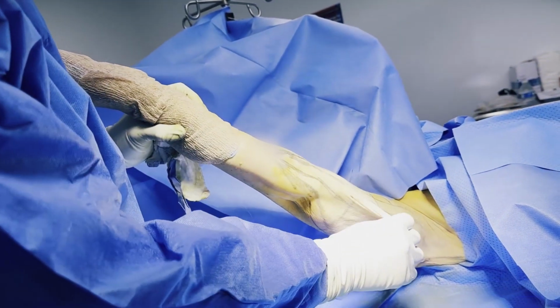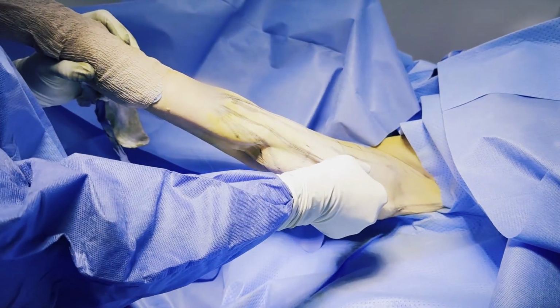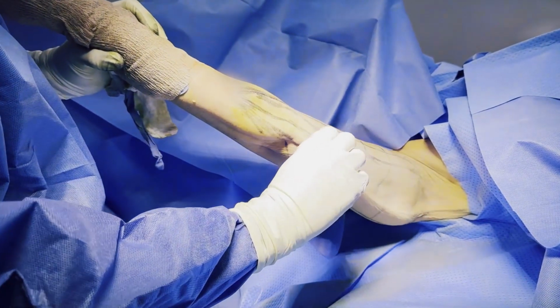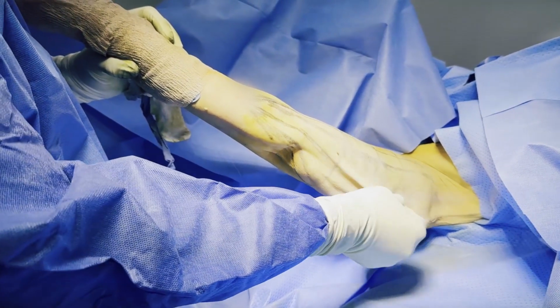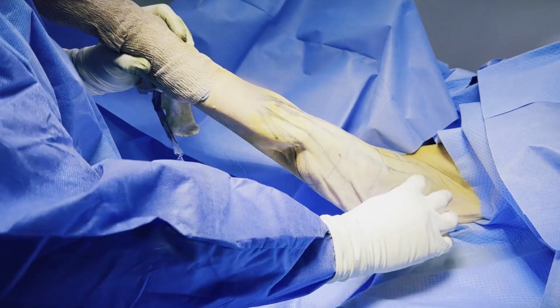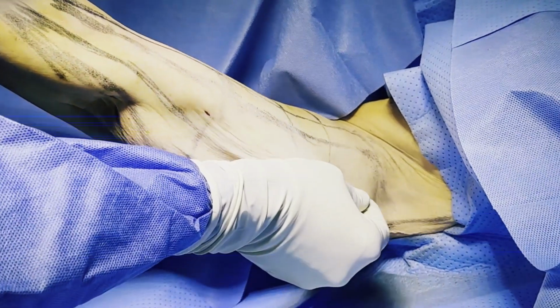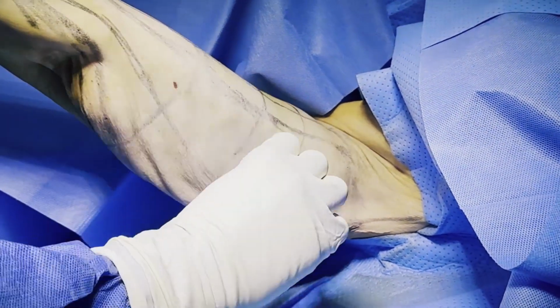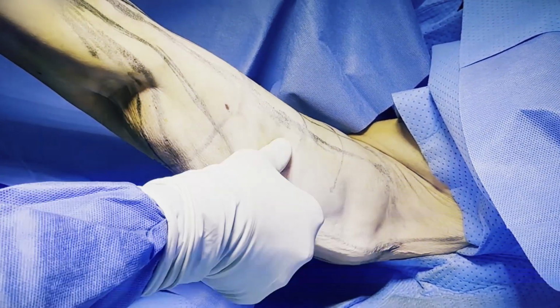We are done with the fat removal, about a liter out from just one arm. You can see this is all skin, so there's no amount of energy devices or anything that will tighten that extra loose skin, because it was loose before, now it's just thinned out. There's no fat. So what we're going to do now is get rid of that extra skin. All this floppy skin is going to get excised. It's going to be a nice linear closure here.